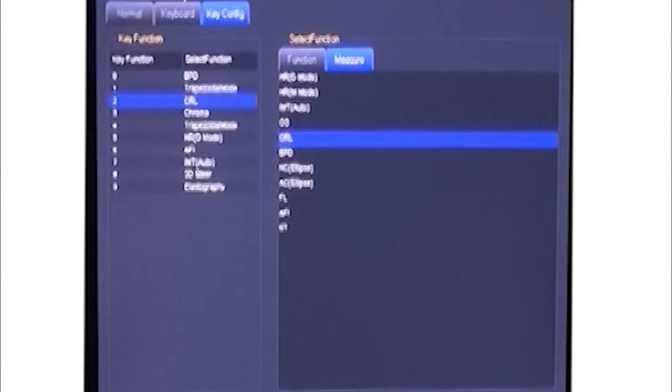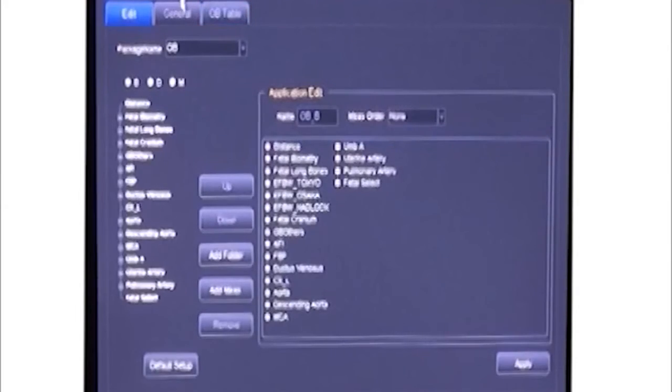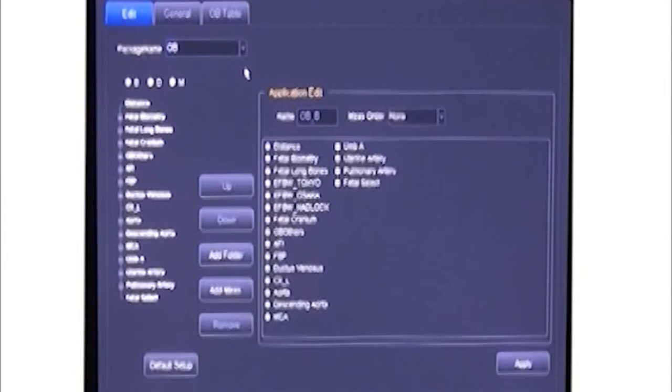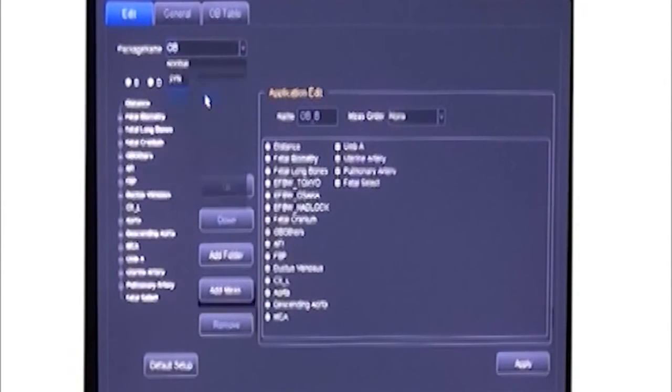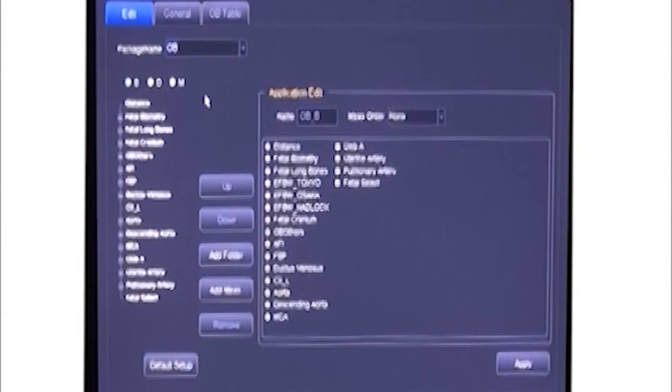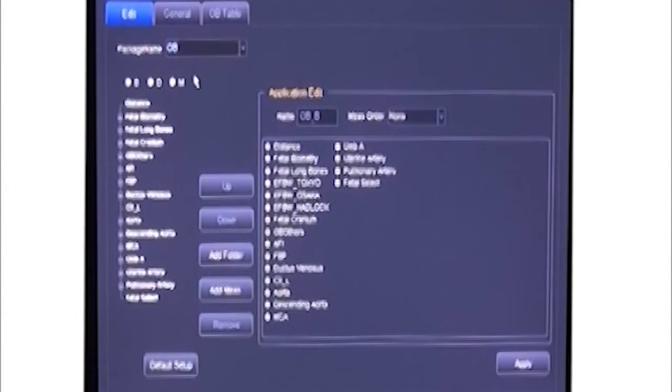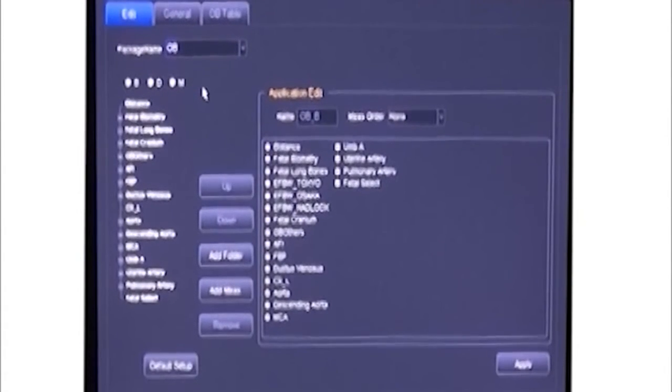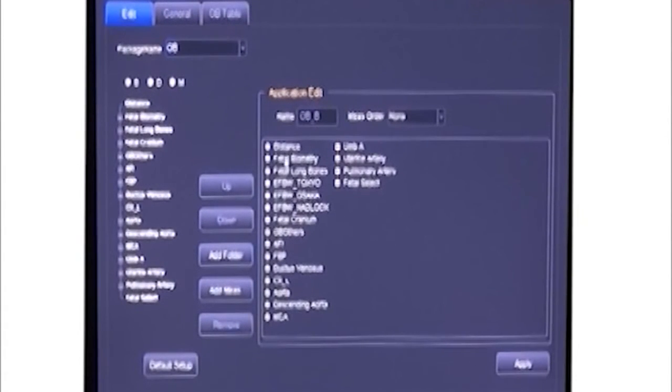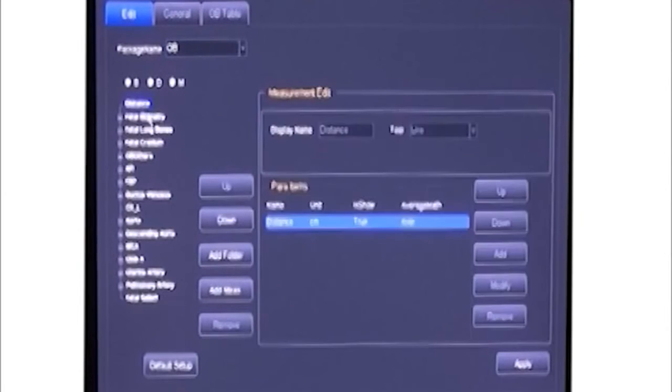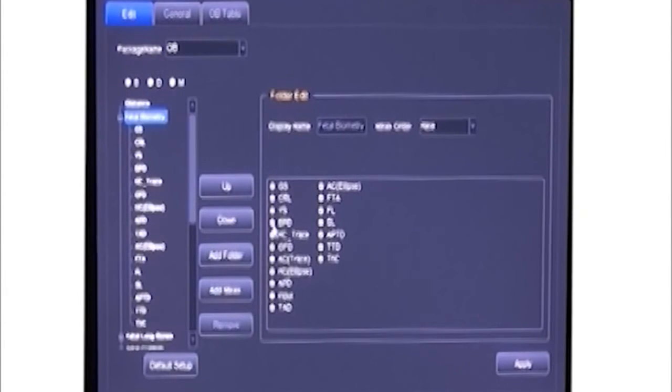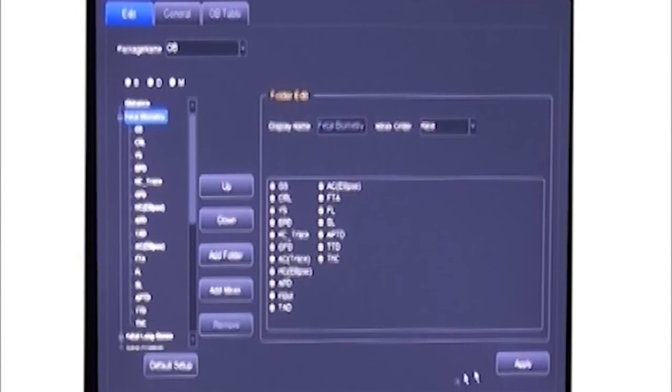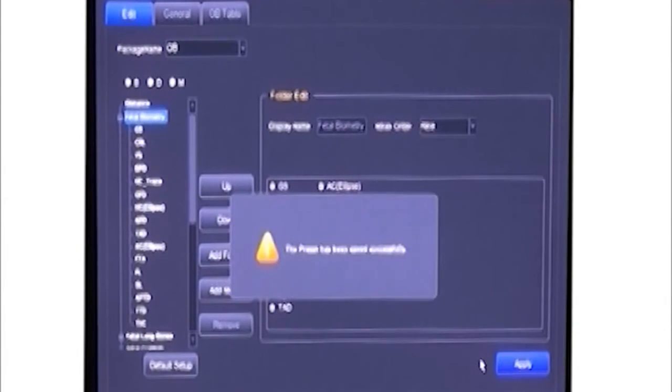Different applications have different calculation packages. We can choose the method we want. Take the OB package for example. We have many kinds of methods inside. Choose what we want and cancel which we don't need, then save. Next time when we open it, it will show what we want.